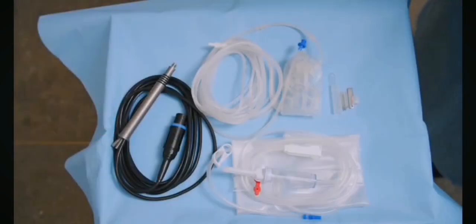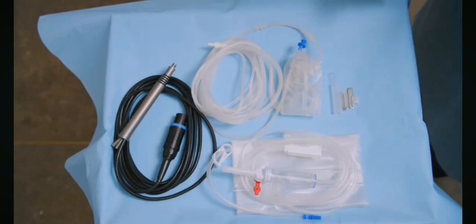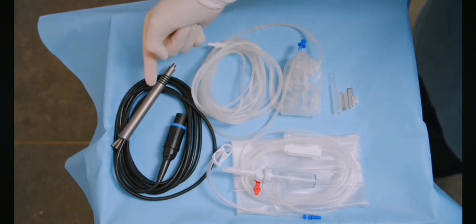Get the handpiece and cassette components ready for setup: FACO tip and accessories, IA cassette with tubing, and FACO handpiece.